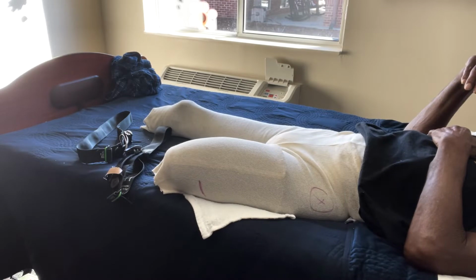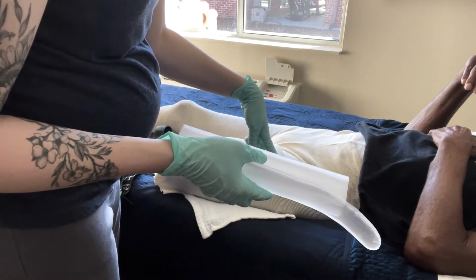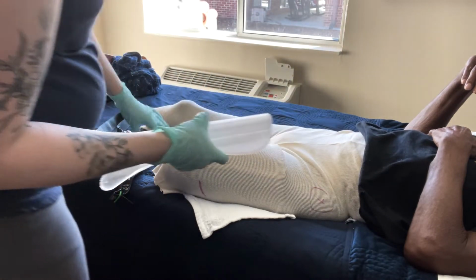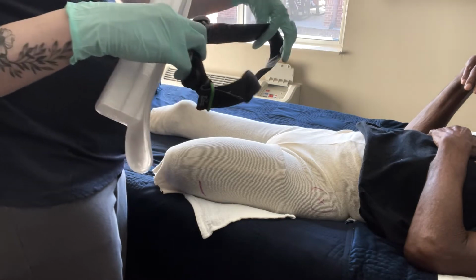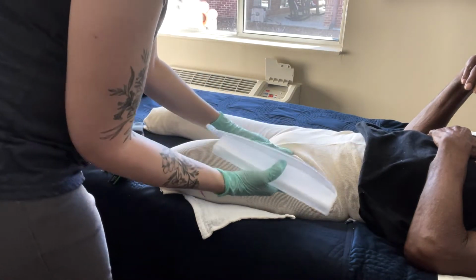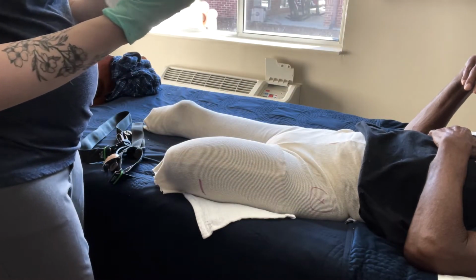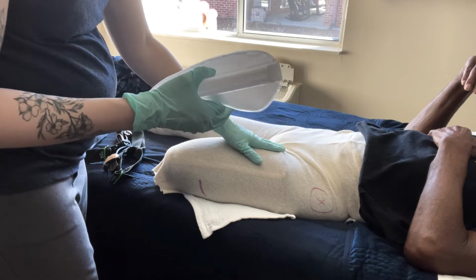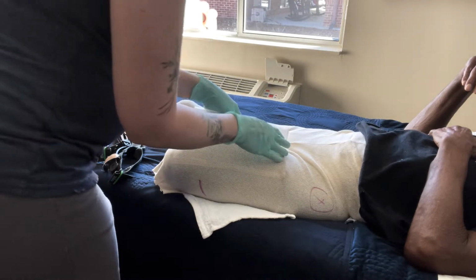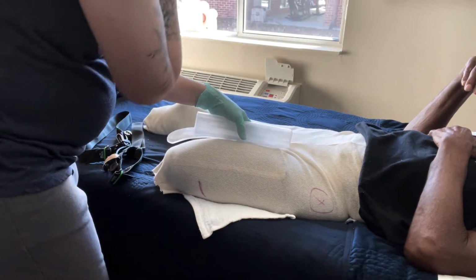So for this one, we'll start with the fiberglass, starting at the top. I'll do a couple wraps at the top and work my way down. And then we have these pieces that these buckles help hold in place. This basically helps create channels in the socket in between your muscle bellies so that it's going to give you better control and so that it doesn't twist on you while you're walking. And it also helps you keep using your muscles to keep them strong.